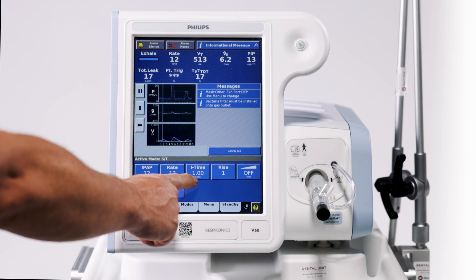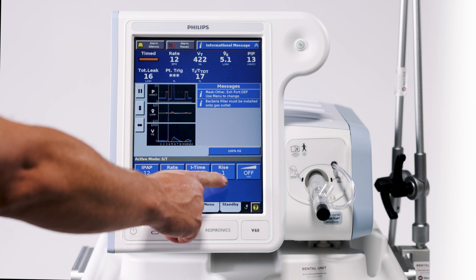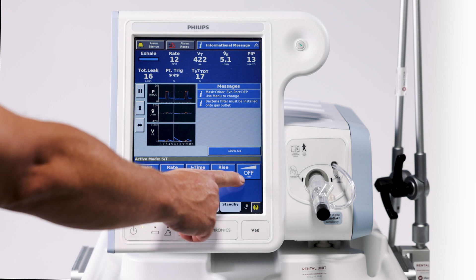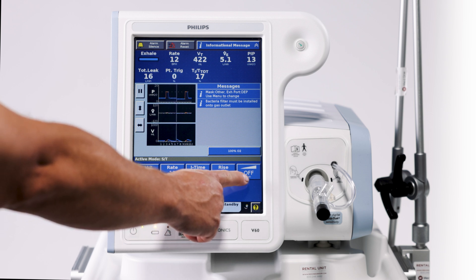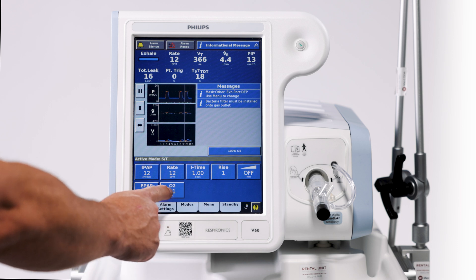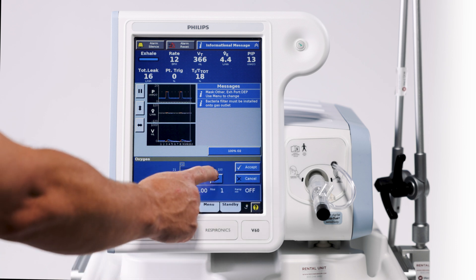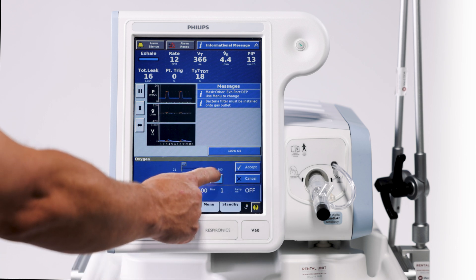We're going to have an inspiratory time of one second, a rise time of one. We're not going to ramp it in — we're going to leave our ramp off. We're going to set 30% FiO2.